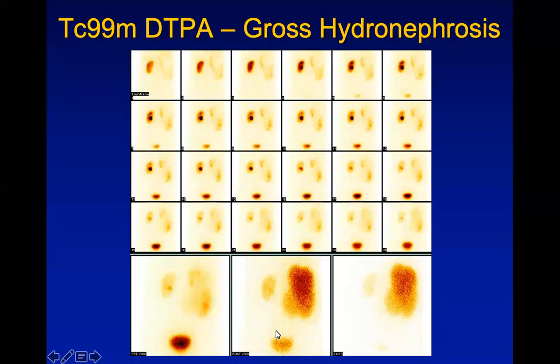Now, this software has a problem in that it normalizes the frame to the highest counts. Because there is a color scale, the darker the color, the higher the counts. So in the first frame, the bladder is full. So maximum, this black and dark color is in the maximum count region, that's the bladder.